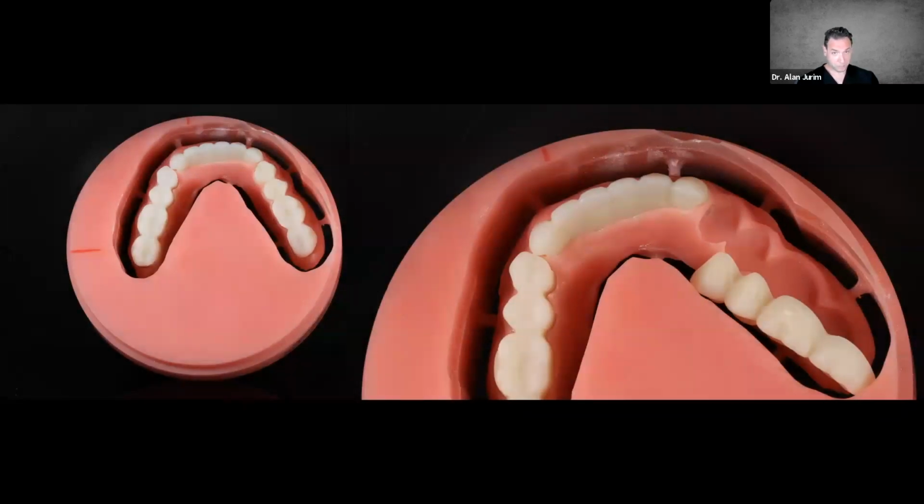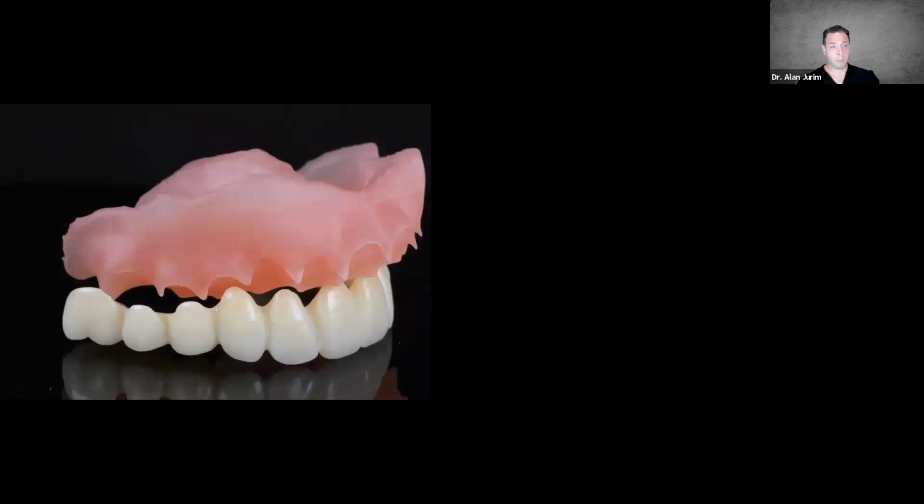And we did this solely for the fact that we didn't have the materials with 3D printing. Now that we have the materials for 3D printing, we've moved into producing a lot more of these dentures with 3D printed materials. As we see here, we have the denture base that's printed and we have the tooth layer. And these will then get assembled together.